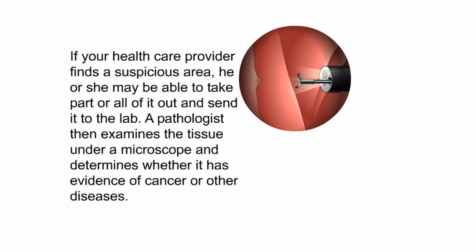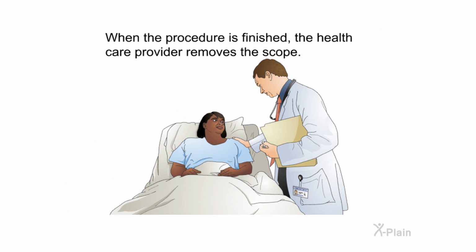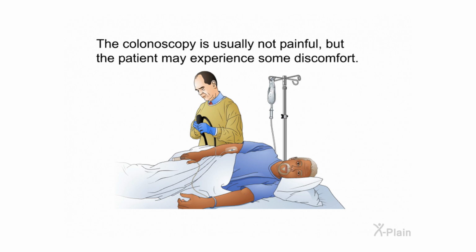If your healthcare provider finds a suspicious area, he or she may be able to take part or all of it out and send it to the lab. A pathologist then examines the tissue under a microscope and determines whether it has evidence of cancer or other diseases. When the procedure is finished, the healthcare provider removes the scope. The colonoscopy is usually not painful, but the patient may experience some discomfort.